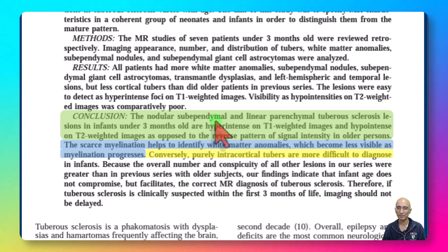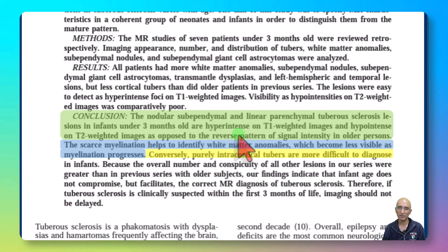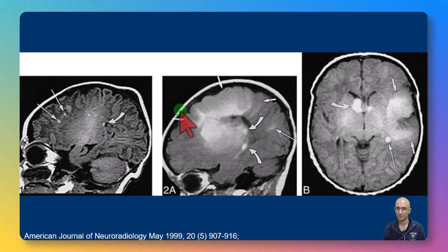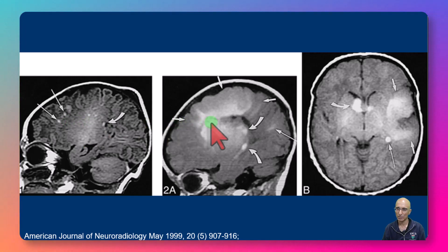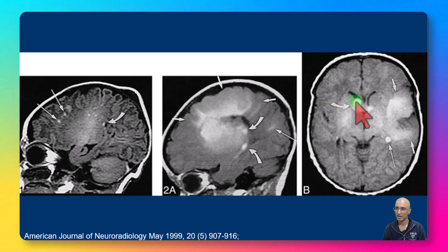MRI is a very good examination if there is clinical concern for tuberous sclerosis. Conversely, pure intracortical tubers may be difficult to identify, although we were able to see them in our patient. The representative images from the article demonstrate T1 hyperintense sub-ependymal nodules, radial bands, and cortical/sub-cortical tubers. In their research, they also found a sub-ependymal giant cell astrocytoma in one of their patients.